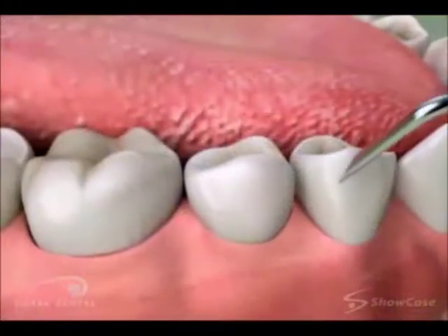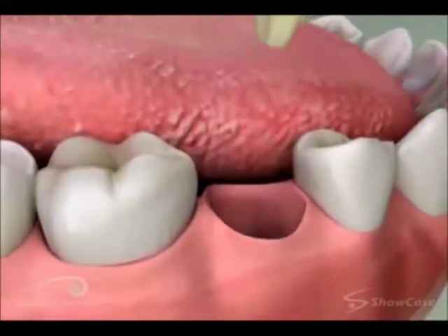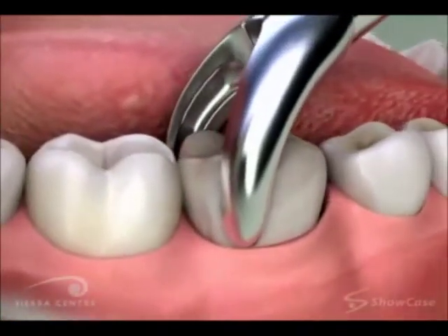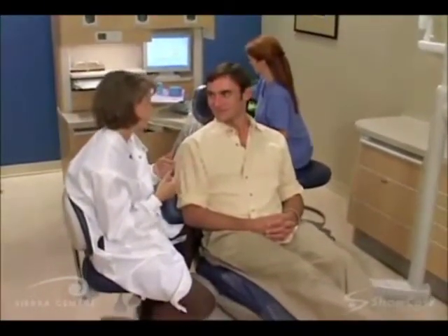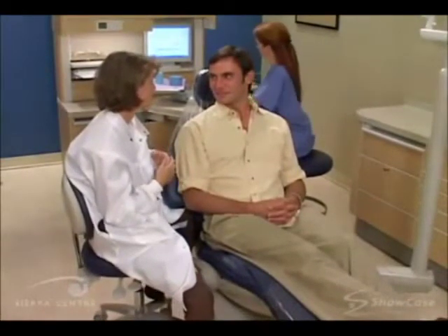We start by loosening the tooth and then remove it from its socket. Depending on the situation, it's sometimes helpful to cut the tooth into sections before removal. Having a tooth extracted is sometimes the best treatment choice, and with modern dental techniques, it should be a comfortable procedure for you.